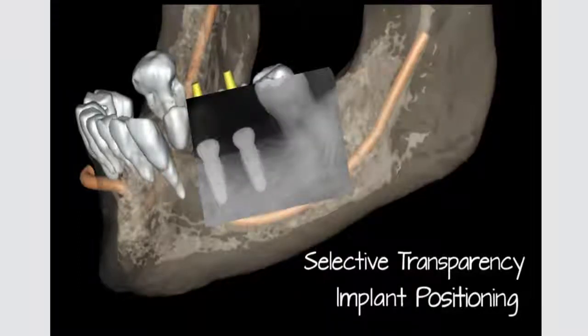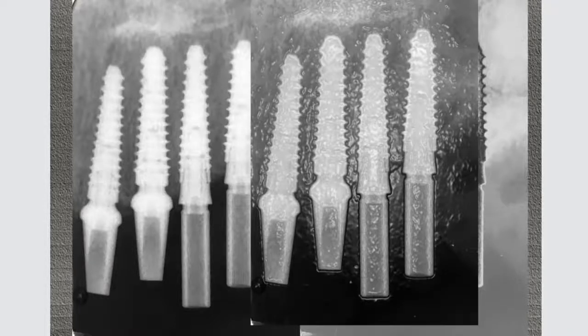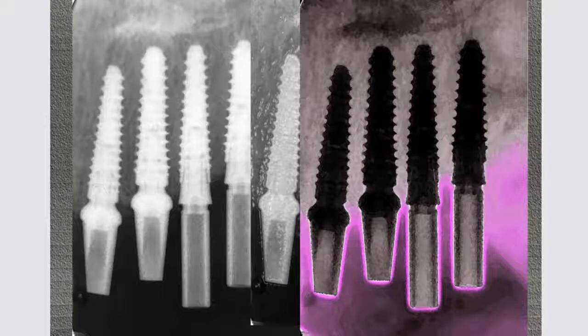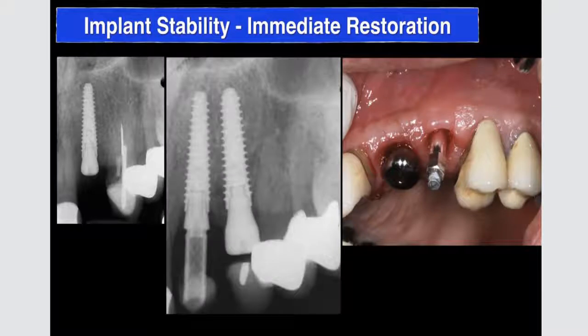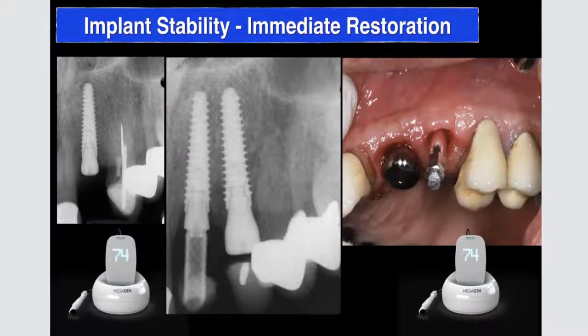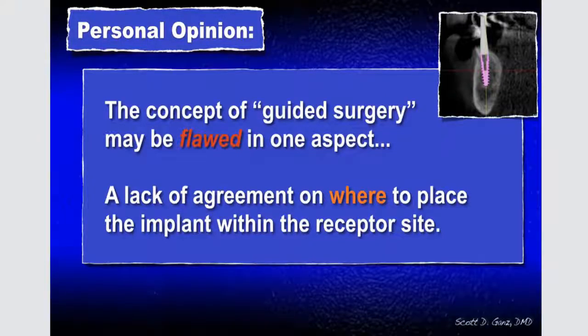So when we're dealing with different implants, different components, different abutments, we have to understand that there are a lot of parts and a lot of pieces. We're not just looking at implant stability, we're also looking at the stability of the abutments. And how do you choose to load an implant or not load an implant? Here you have two side-by-side implants, and we have to be able to visualize and objectively measure implant stability with resonance frequency analysis and get an ISQ value.